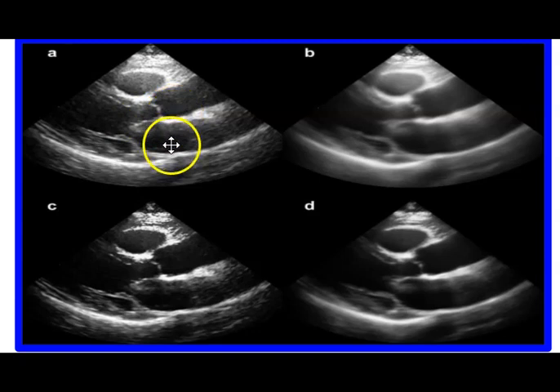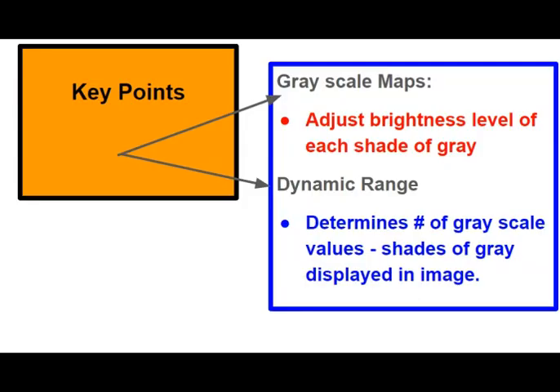When the doctors want to see, they want to see the endocardium, the inside wall of the left ventricle. That's what has to thicken in systole. It's very important for them to see that.